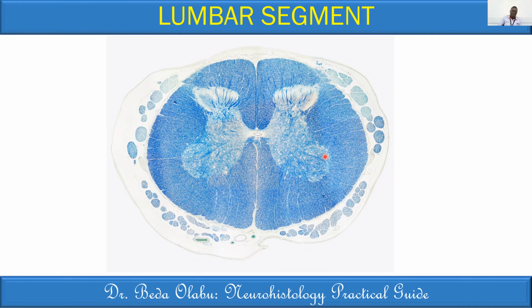So it's equivocal there. Anyway, with the findings that we've stated, this confirms a lumbar cord. We may not specify which segment of the cord, L1, L2, L3, L4, L5, but it's largely a lumbar spinal cord. All right.